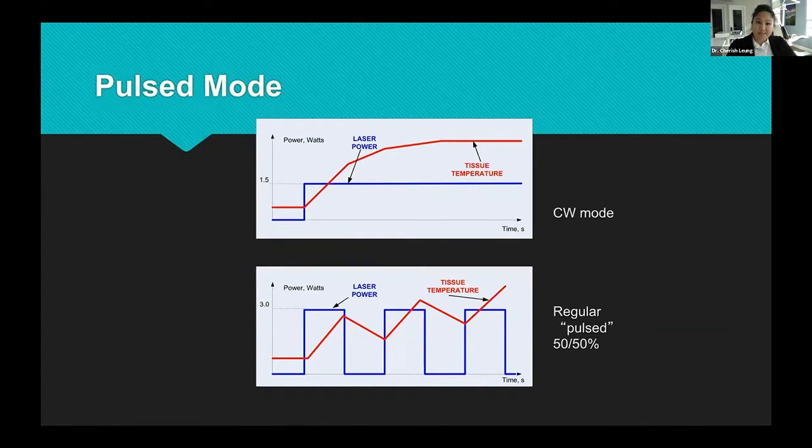What that means is that you can basically injure the tissue, you can cause damage to adjacent tissues. And that happens because while you're doing it the entire time, it's heating up the tissue. So then that can increase the tissue temperature, which causes damage.